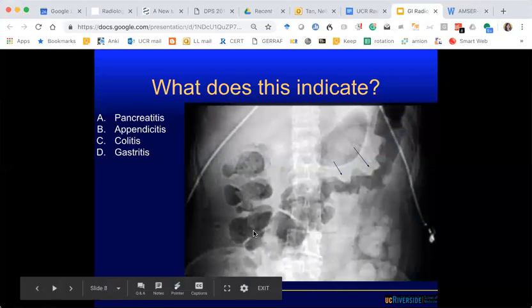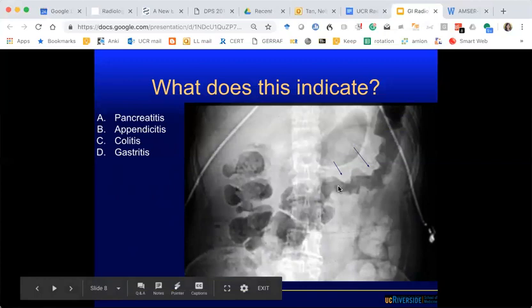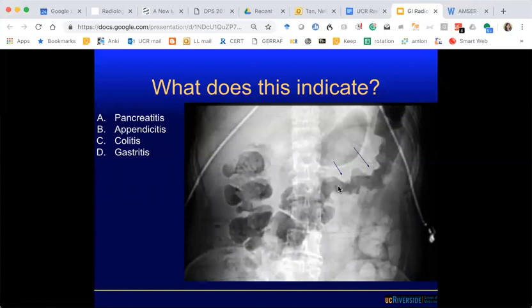This is an abdominal radiograph, frontal view. The consensus is colitis. For bonus points, which segment of the colon do you think is involved? Everyone thinks it's the transverse colon.